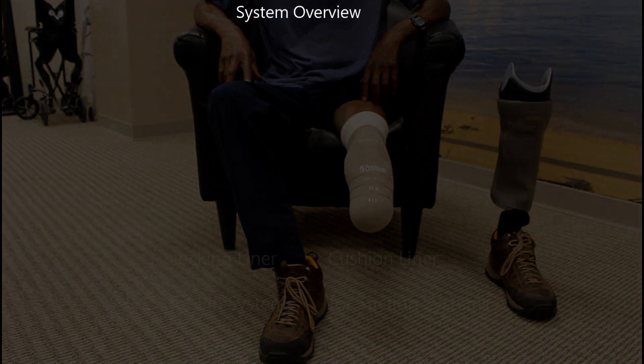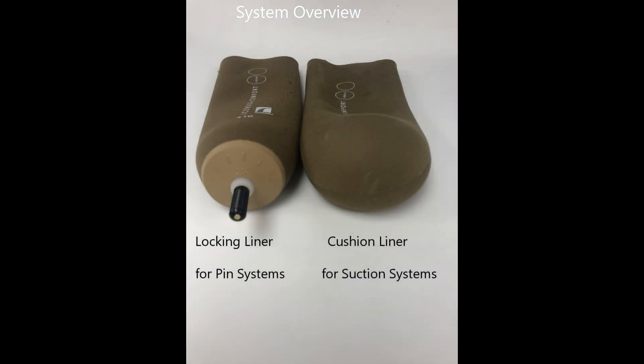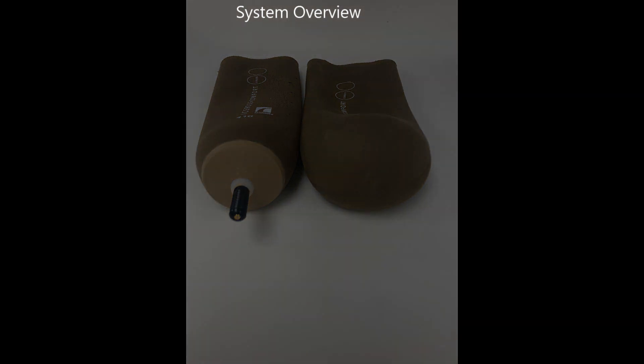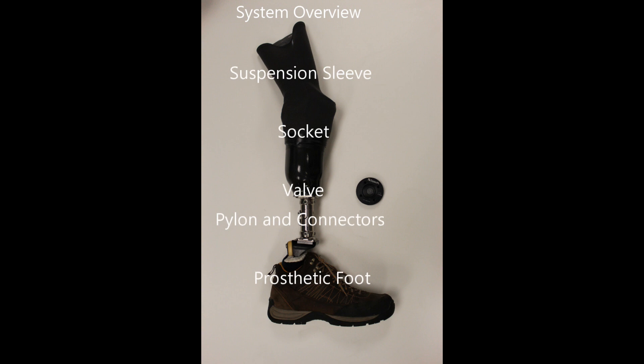A gel liner is worn on your limb, similar to a pin locking system, except that the liner used does not have any threaded receiver on the end of the liner. It is completely soft and flexible.